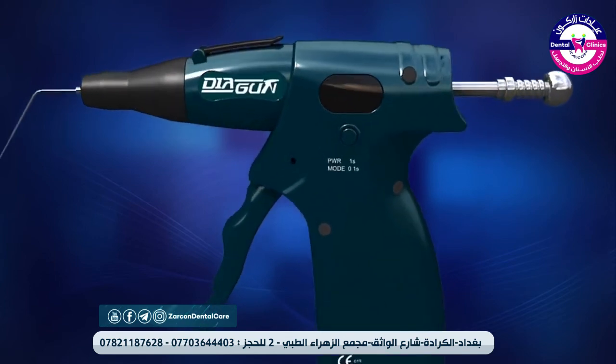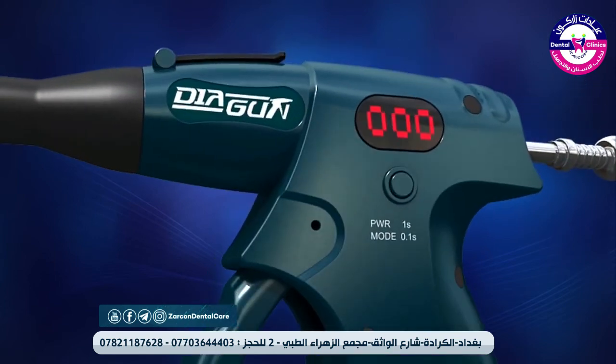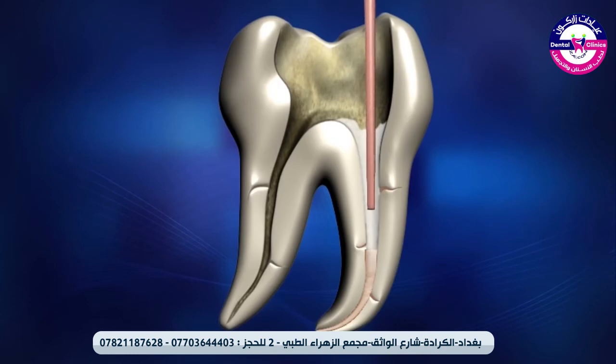Using Diadent's Dia Gun, press the power button for 1 to 2 seconds to activate the unit and to adjust to the desired temperature. Using Dia Gun's tip, make contact with the upper part of the remaining gutta percha material in the canal and transfer heat for 3 to 5 seconds to soften the material. Using the backfill technique, begin extruding the melted gutta percha obturator so that only 2 to 3 millimeters of the canal is filled behind the apical plug.